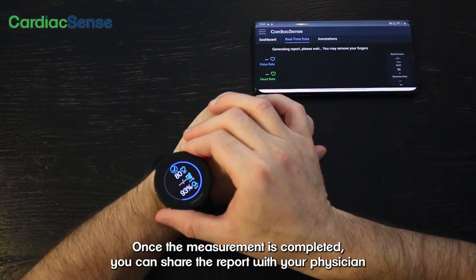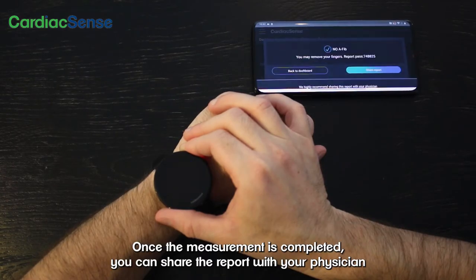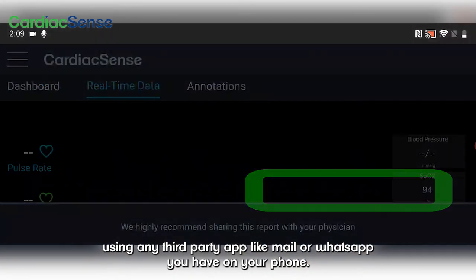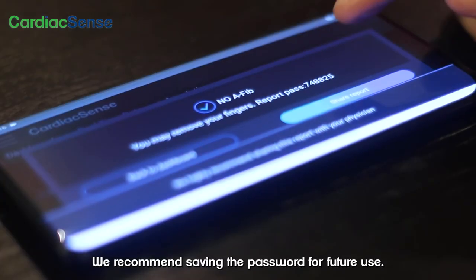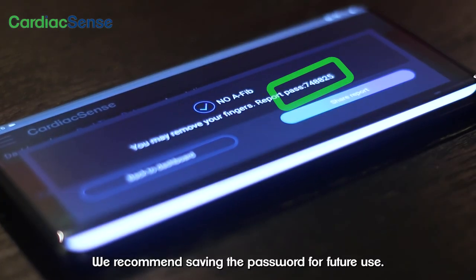Once the measurement is completed, you can share the report with your physician using any third-party app like mail or WhatsApp you have on your phone. We recommend saving the password for future use.